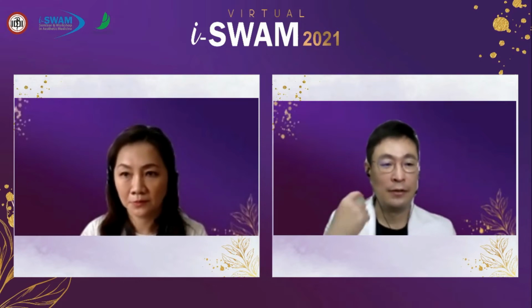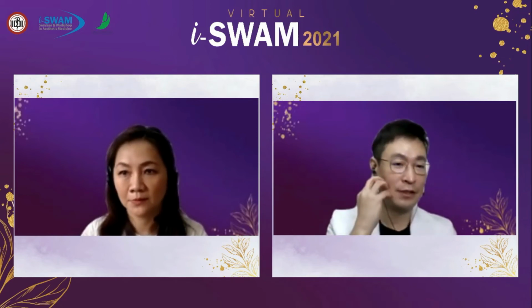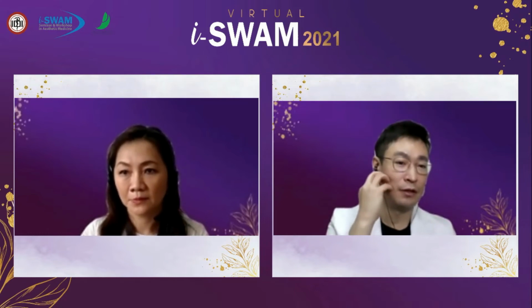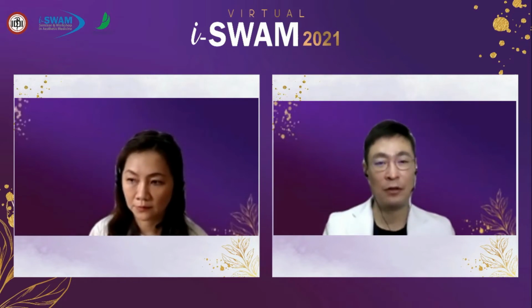So I inject the filler first, but less volume than usual, because I will lift this part and reposition it to some degree.